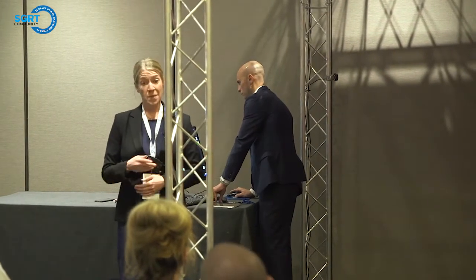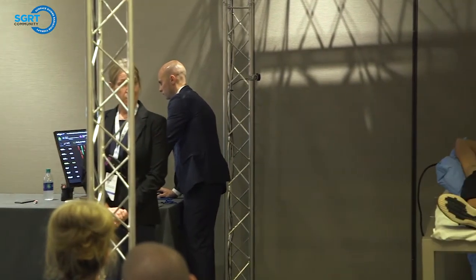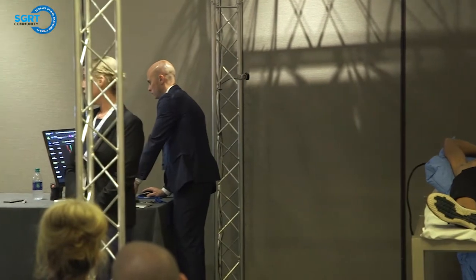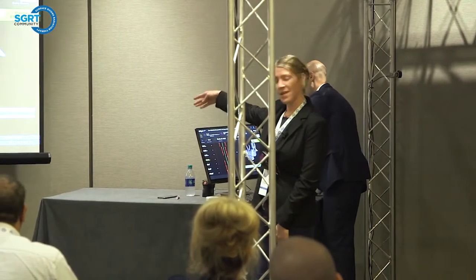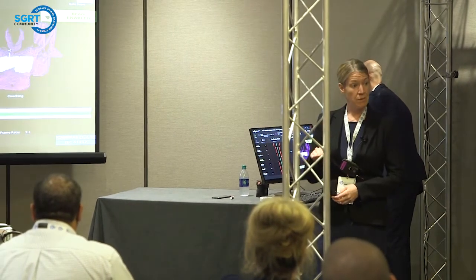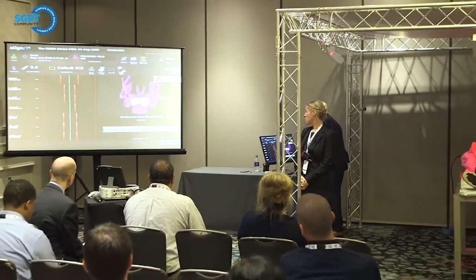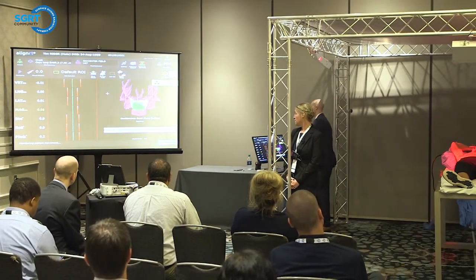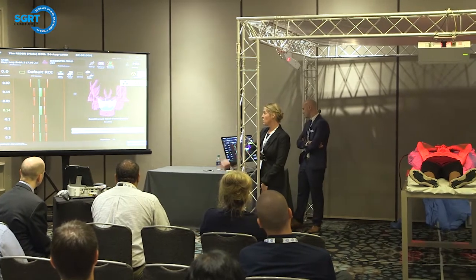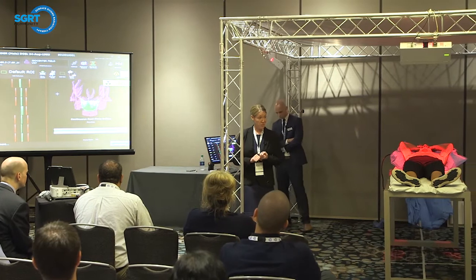So once we shift the patient, we're going to take a new reference capture of the patient. And what that will do is update your patient position on the right side of the screen here. So it'll be the new position on the treatment table, including the shifts that you made from imaging. Okay, so now that our deltas are zeroed out from that reference, we would go ahead and treat our patient.